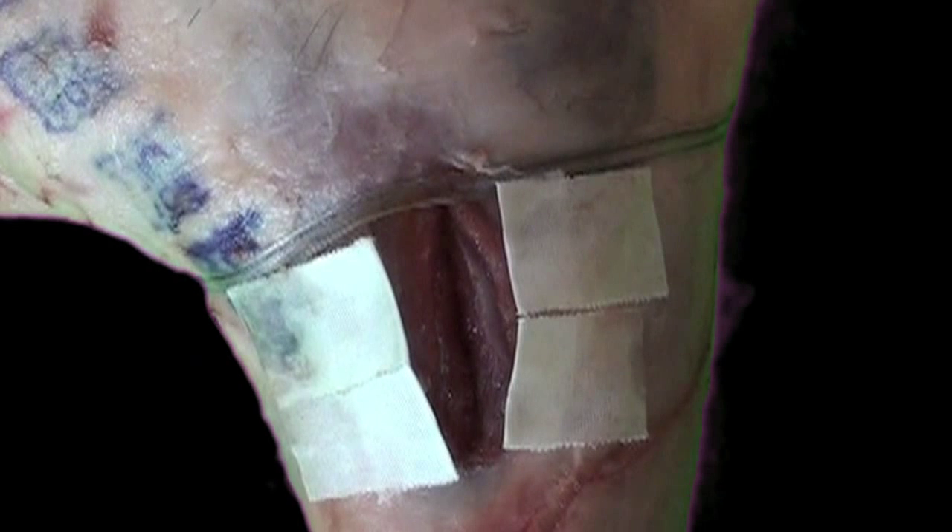The next step is to apply tissue adhesive on the sides of the wound and then take pieces of silk tape with the ends folded over and place the sticky sides over where you put the wound adhesive, leaving a little folded-over tab free just a couple of millimeters shy of the wound margins.